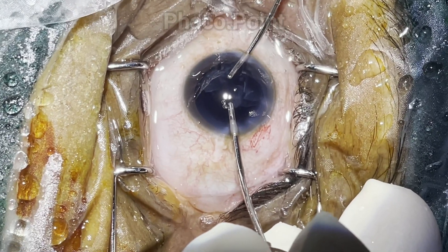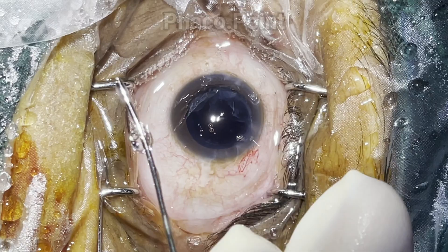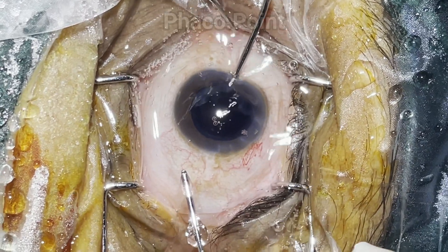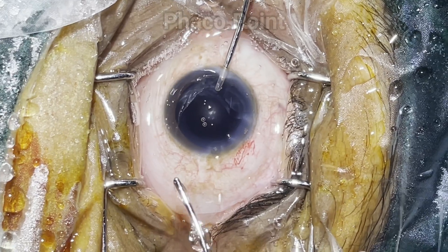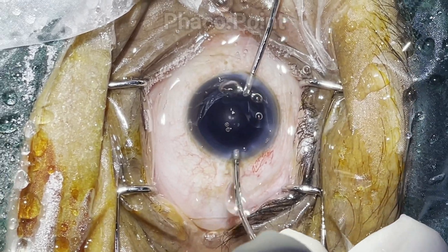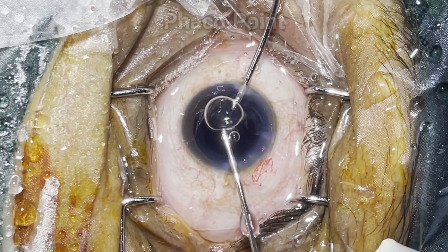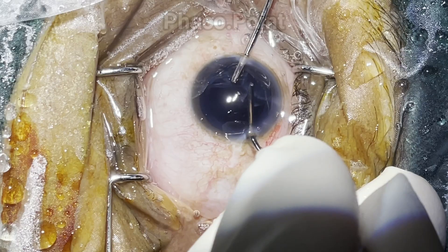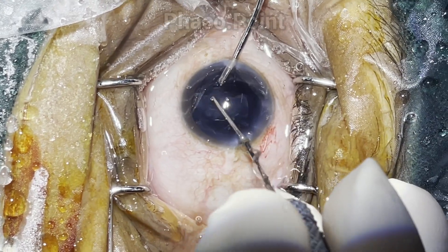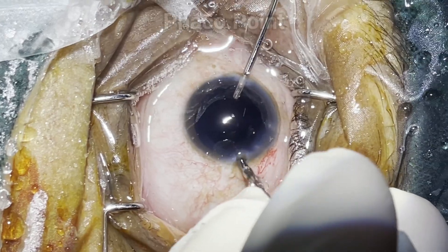Once that is done, the hands are swapped around. The irrigation now enters the eye held in my non-dominant right hand, while my dominant hand — the same hand that's going to be used to inject the IOL — completes the second half of the bimanual irrigation aspiration, wherein in a circumferential manner the entire cortex is removed.